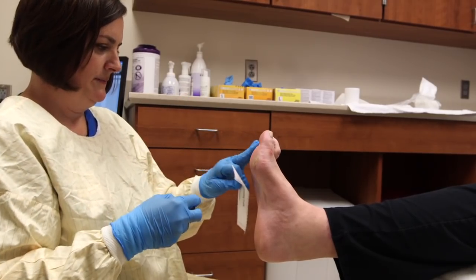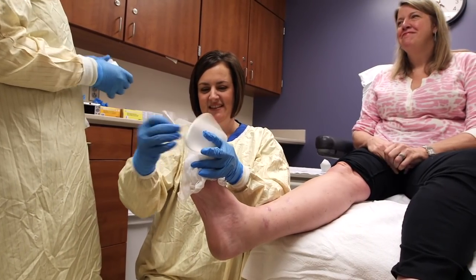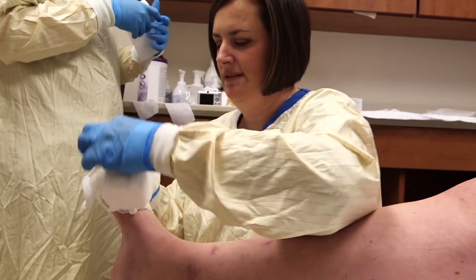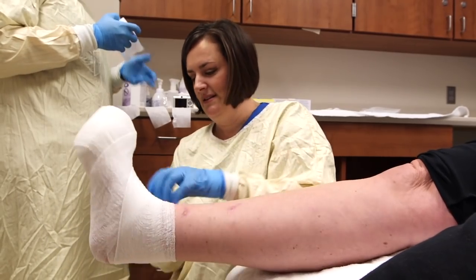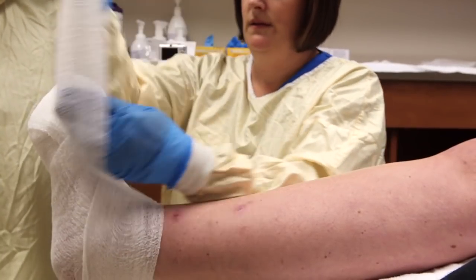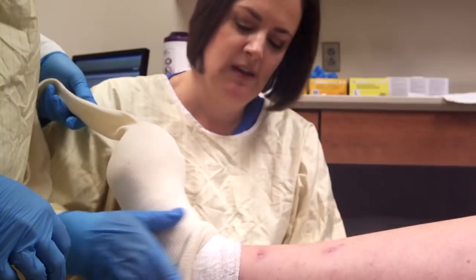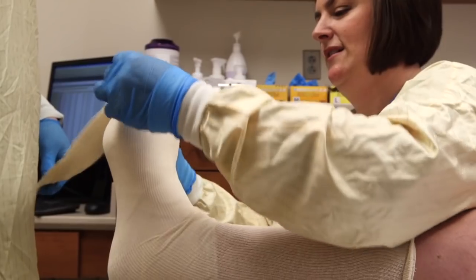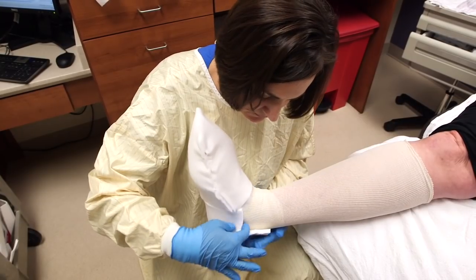What makes a custom total contact cast unique is two things. First, the hard part of the cast — the material that you're used to seeing — absorbs about 30% of your body weight. The inside of the cast, the custom parts, do the rest of the work. They're put on to dangle the wound in space so that the wound doesn't get pressure. They essentially make the rest of the body weight go through the healthy part of your foot. So between the hard part of the cast, the custom padding inside, and the foot plate, our goal is that your wound essentially gets no pressure on it, and that's what allows it to heal.